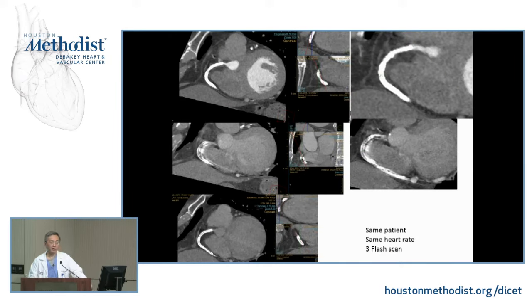This is a very interesting case that I just ran across by doing a very specific study. A patient who came in, that we decided to do a flash scan with flash mode, for a fellow who hasn't done CT. Our scanner is special because we have two sources, which allow us to scan really quickly. We can do the scan in 275 to 300 milliseconds. The scanner can go very fast, covering the entire heart in one third of the cardiac cycle mostly.